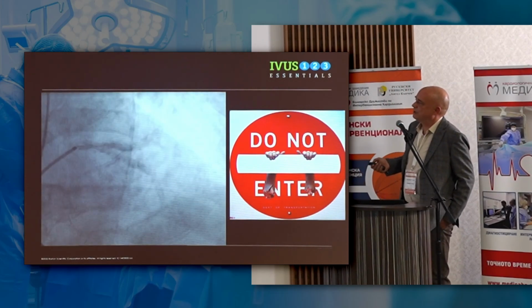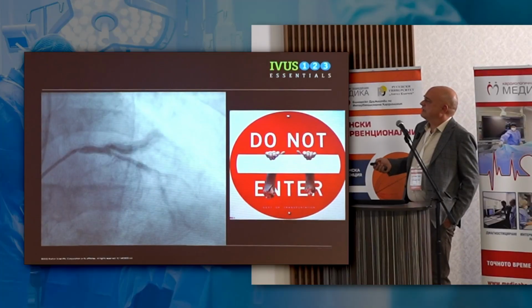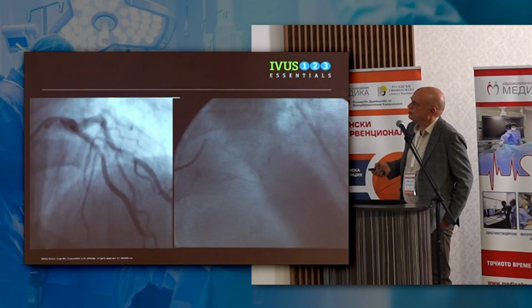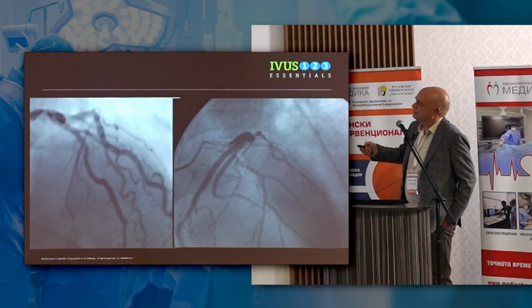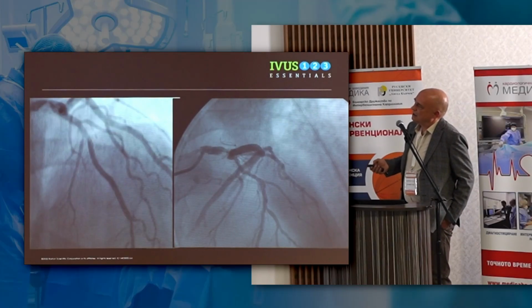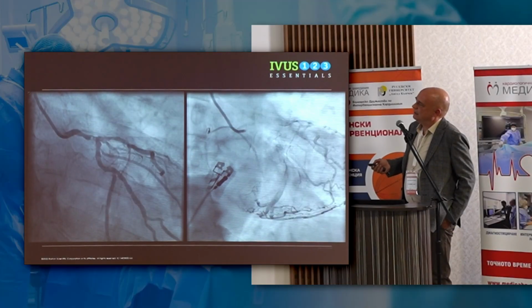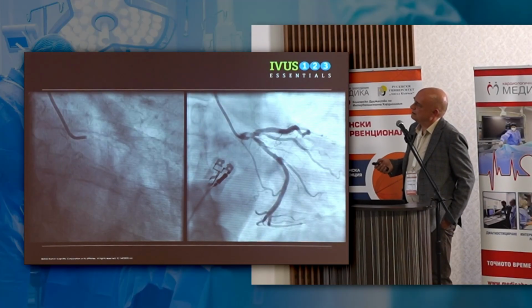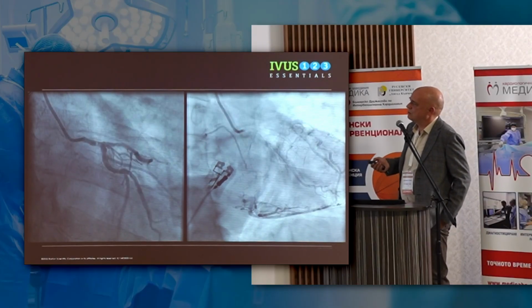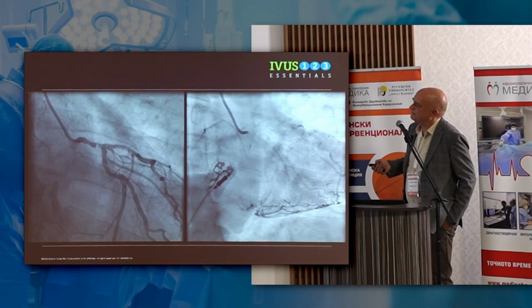But for sure, when you have such a case in the cath lab, you can only cry, because it is a very, very complex procedure. Also, these patients are very complex PCI, so we must say that a certain number of patients in the Nobel study had very complex anatomical features.